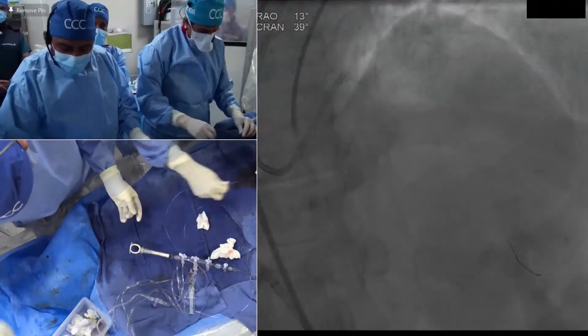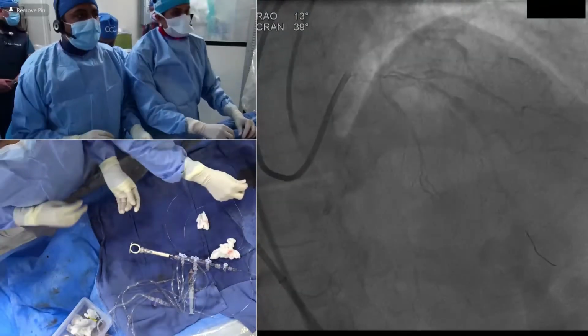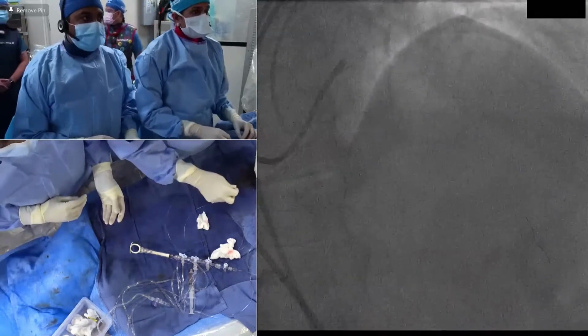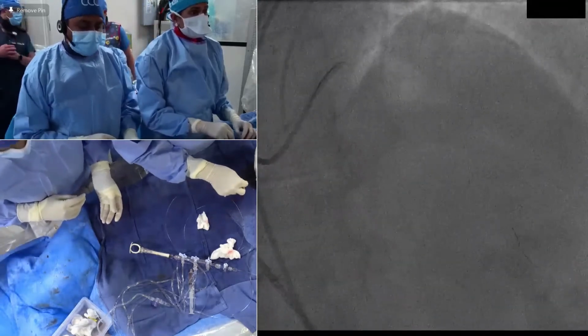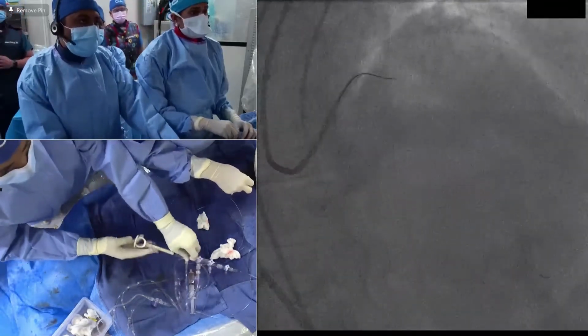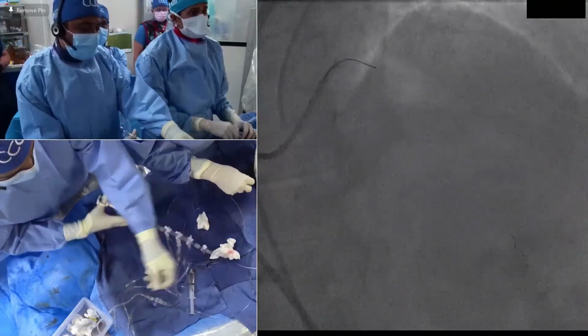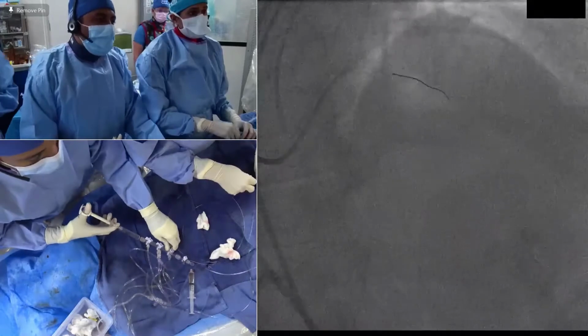As you know, at present we do standalone rotablation at BI, and then we started at South Nassau. Now we started with Duvuri line at Staten Island.